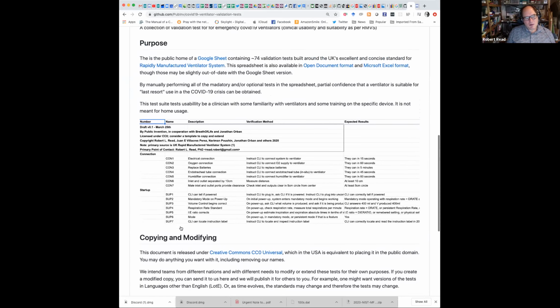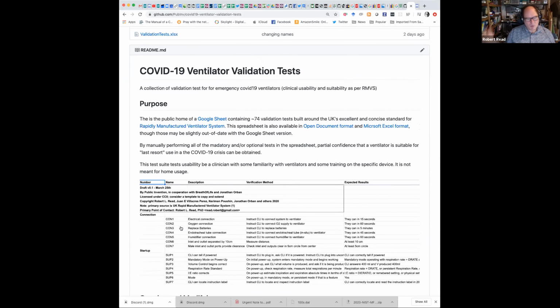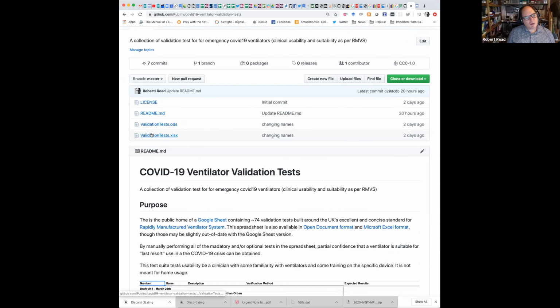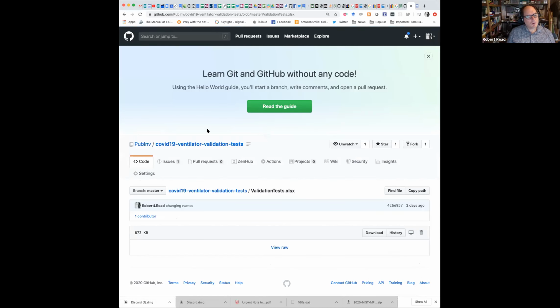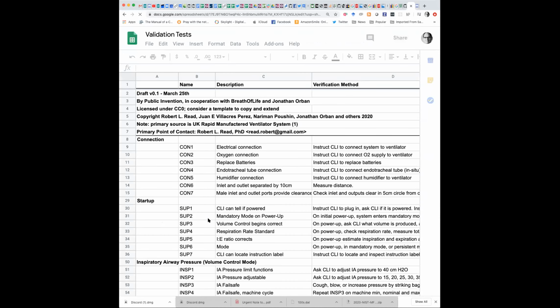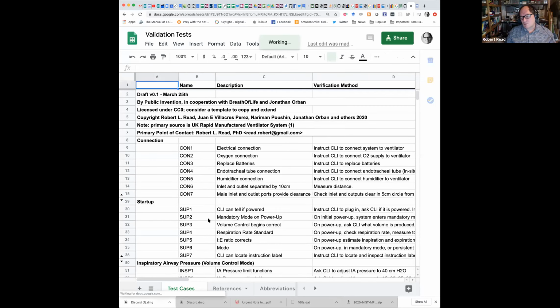And so any team, like the German team or the Florida team or whatever, could at least run through these spreadsheets of tests. They're in a Google Sheet as well as Excel. And this is what I would consider a baseline test, right? It's not sufficient. And then you need something like a test lung or my system. You should probably really use both for that.